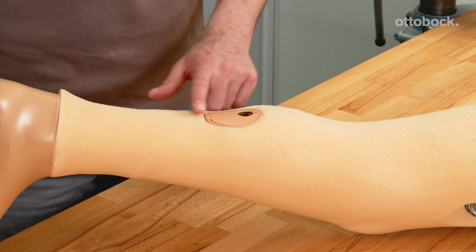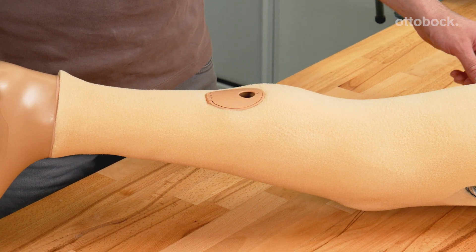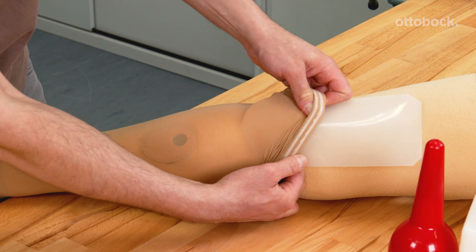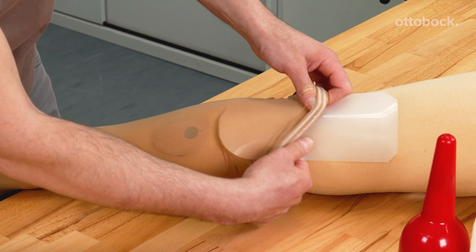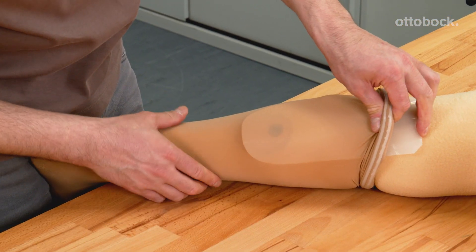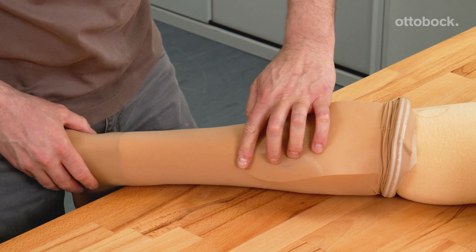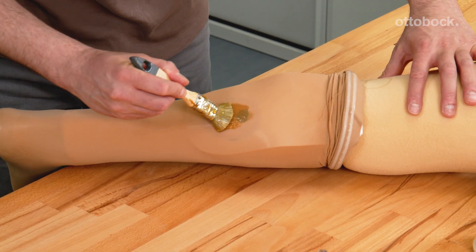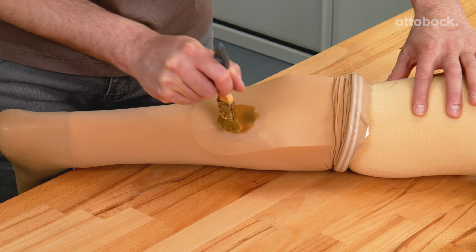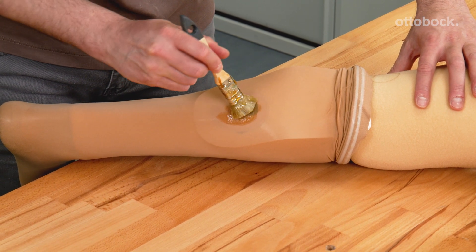To finish the foam cover and improve the aesthetics, cosmetic stockings can be applied. To allow access to the charger, it is necessary to expose the charging shaft cover. Sliding a thin sheet of trolin under the stockings will protect the charging shaft cover. Glue can be applied to the stockings over this area, ensuring the area is not too large.